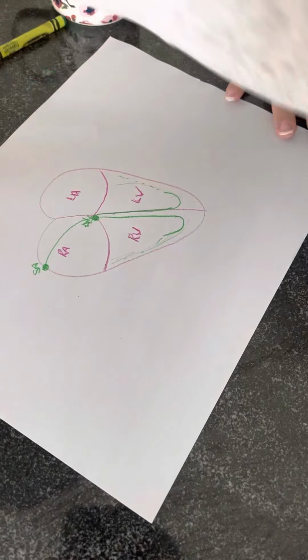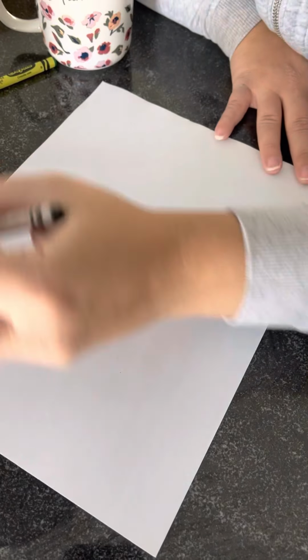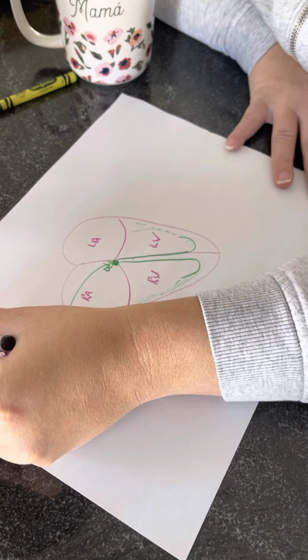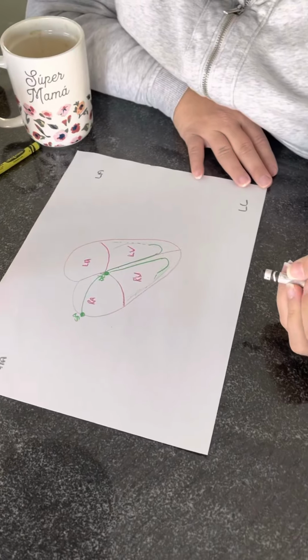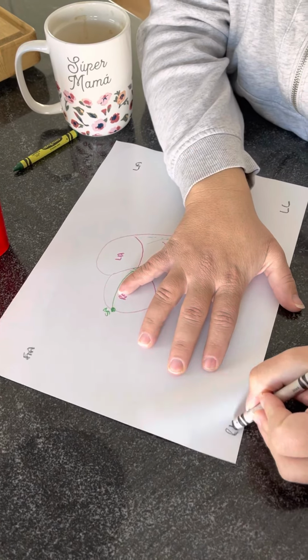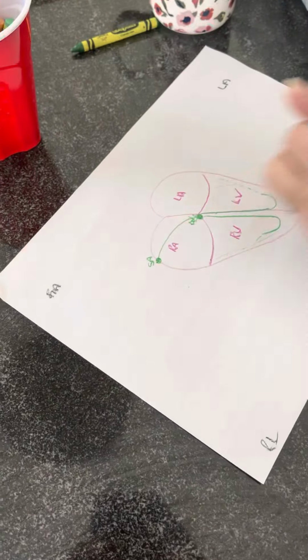When you look at the limb leads, so you have right arm, left arm, left leg, right leg. Okay. So the limb leads read from limb to limb.